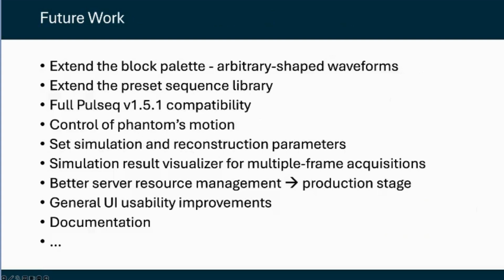Then on the simulation side, we want to expose more parameters, both from the scanner and the reconstruction, and to give the user more control over phantom motion. So you can even define this motion in an easy way. For dynamic acquisitions, we are planning a better visualizer that can handle multi-frame simulation outputs. And then there is all the infrastructure work, like improving server resource management, so we can move from a prototype to something closer to a production environment.